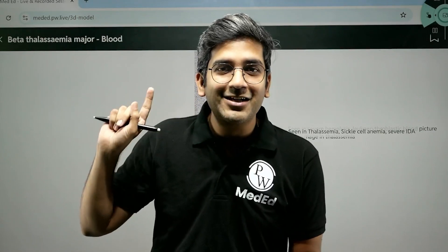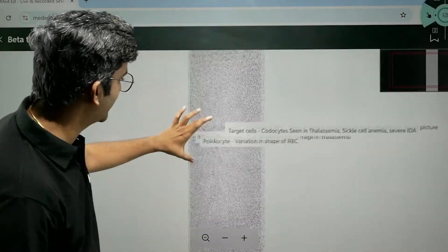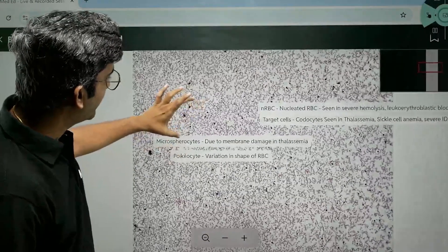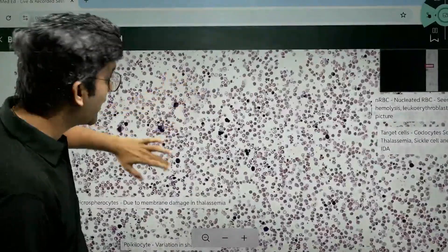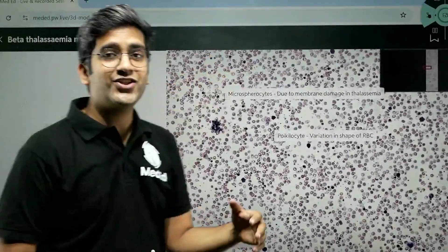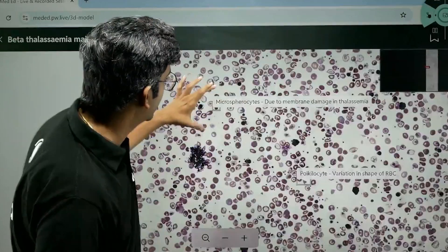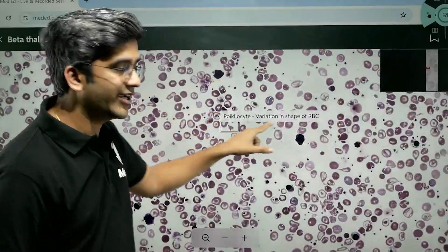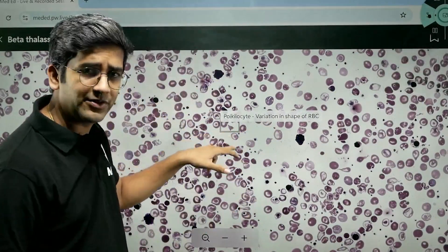Beta thalassemia major — I'm sure you've studied about that. Lots of PYQs and MCQs come with respect to beta thalassemia major. But just seeing one target cell in a random MCQ, you may not be able to identify the same target cell in a real-life or university exam because of subtle variations — and that's sorted here. If you zoom this image, there's a classical peripheral smear picture of beta thalassemia, marked exactly. It's not just to see the finding — it's to revise it. A microspherocyte due to membrane damage — it's written why it is present. A poikilocyte — a variation in the shape of the RBC, obviously not the normal shape.